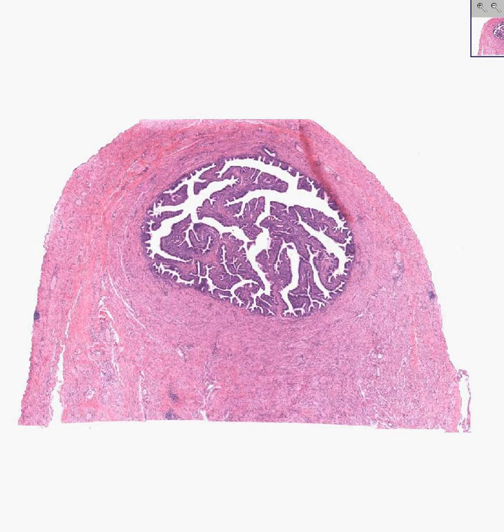This is the world's most classical fallopian tube. As you know, the fallopian tube is a connection from the lumen of the uterus, called the endometrial cavity, to the abdominal cavity. It is a free connection from the outside of the body to the inside of the abdomen.